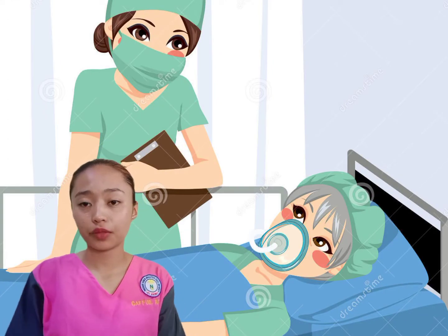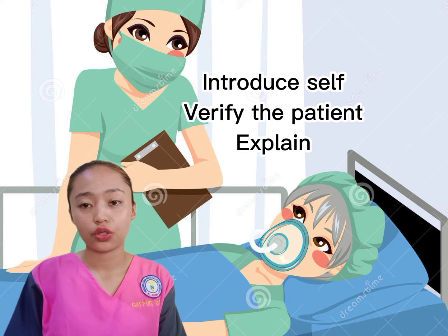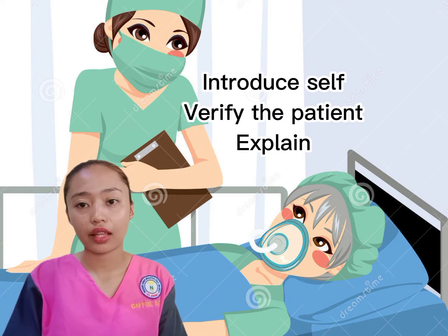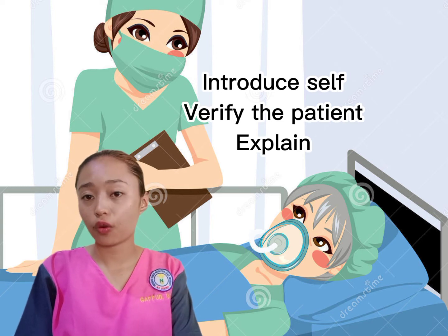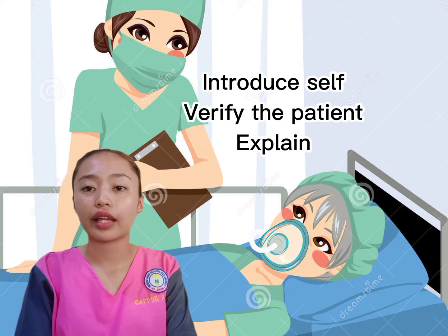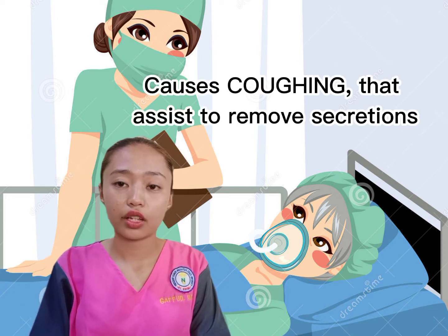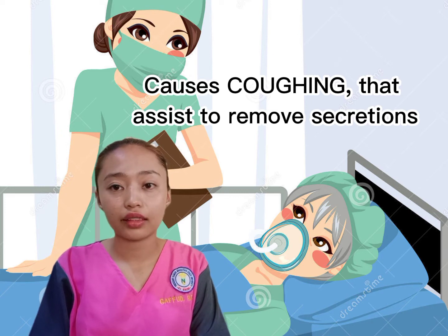Prior to performing the procedure, introduce yourself and verify the client's identity. So you can ask their names and see their identification tags. And then, explain what you are going to do, why it is necessary, and how he or she can cooperate. Inform the patient that suctioning usually causes intermittent coughing and that this assists in removing the secretions.